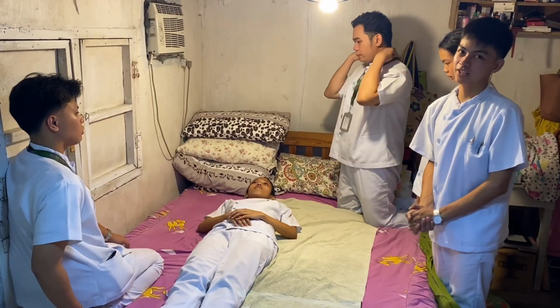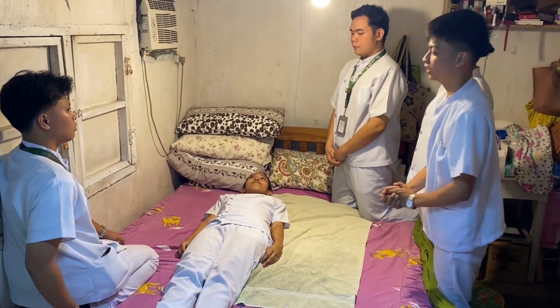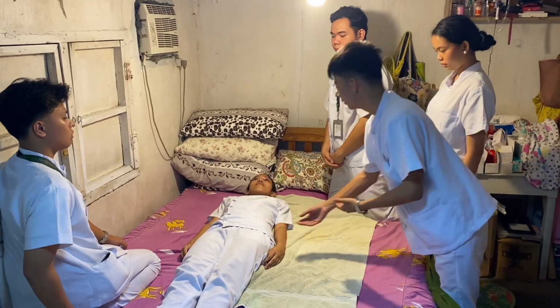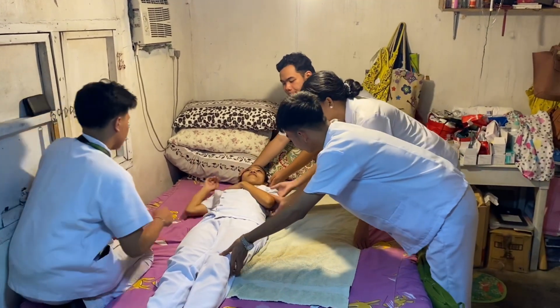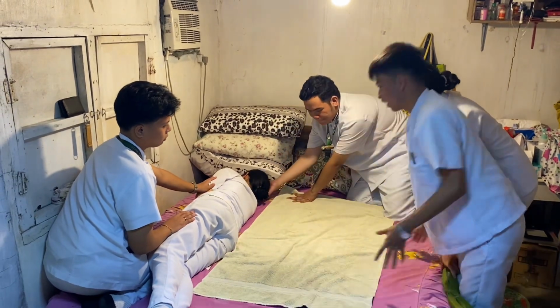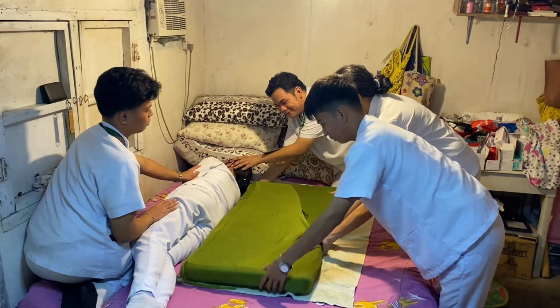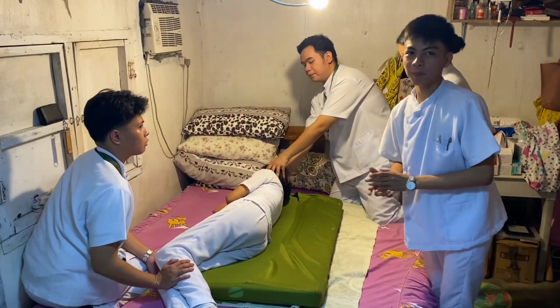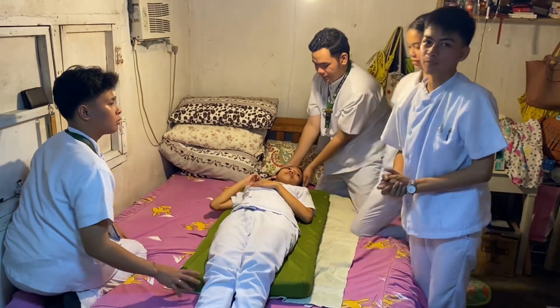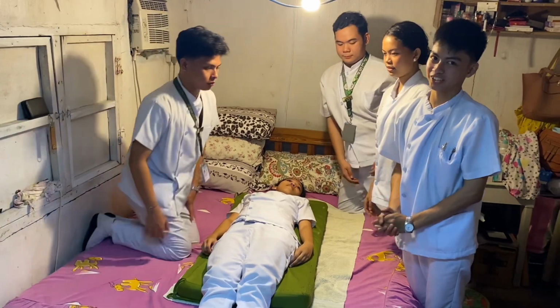For the other variation, we are going to transfer the patient using a transfer board. To do that, we need to turn the patient into a lateral position facing away from us. And then put the transfer board at the back of the patient, close to the back of the patient. And then roll the patient onto the transfer board. And then pull the transfer board and the patient across the bed to the stretcher.